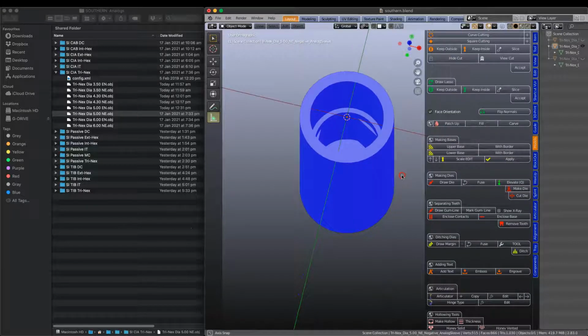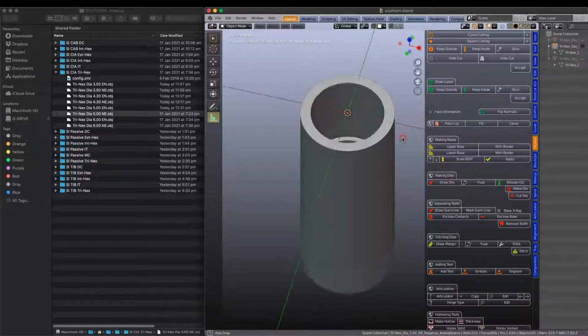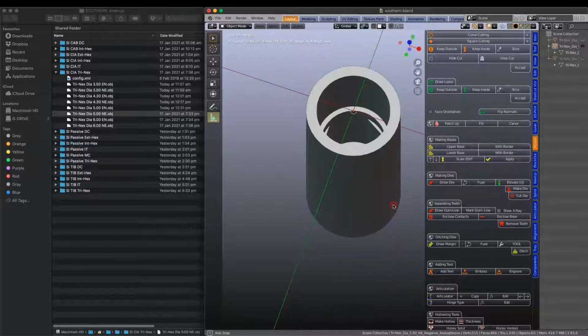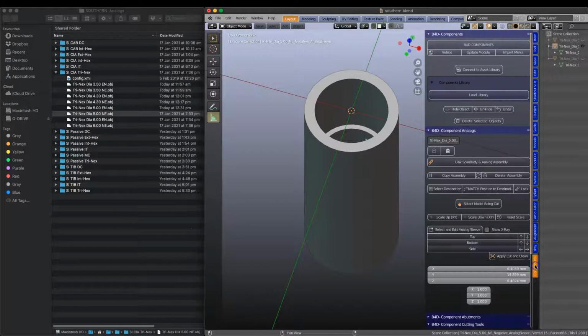So in our situation, we have made a model which will be inserted into the finished dental model. If you find that your expansion of your print resin is still tight, the component is still very tight to fit in, fortunately in the menu we have a scale button that you can use. We have scale buttons. So this would scale the mesh geometry of the whole, at least the whole object, out in a X and Y plane.